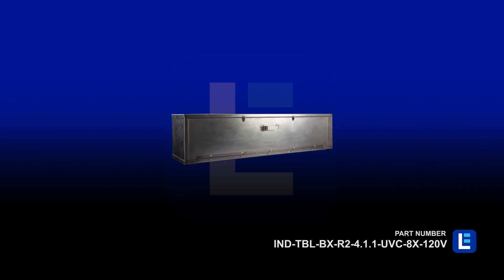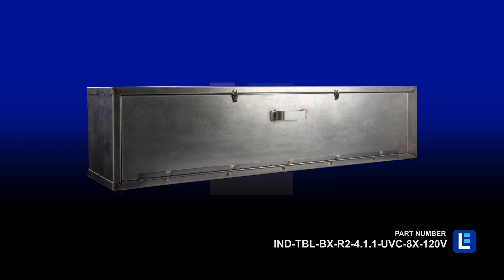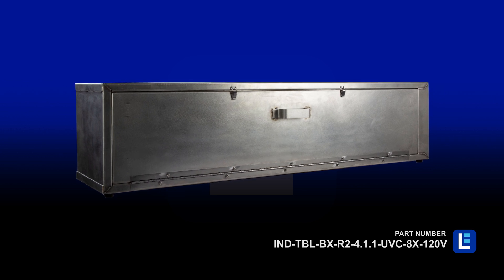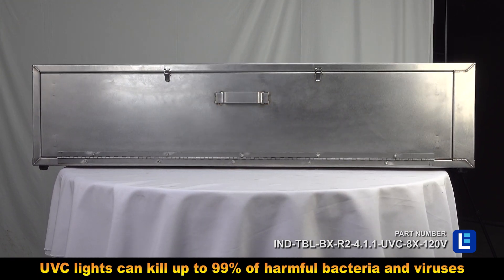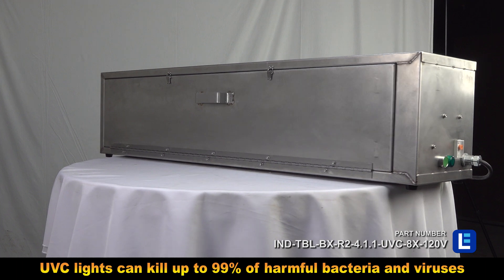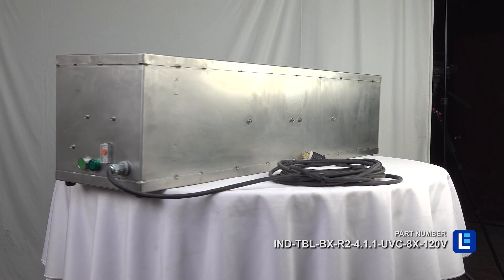The Larson Electronics IND-TBL-BXR2-4.1.1-UVC-8X120V is a medical-grade rapid antiviral and antibacterial decontamination box which can disinfect and kill 99% of viruses, bacteria, mold, and spores found on tools, medical equipment, and work devices.